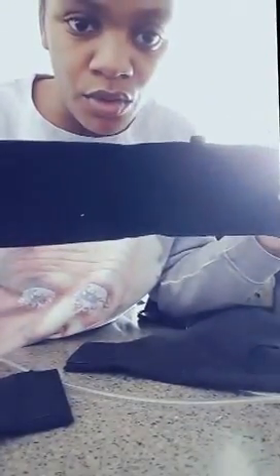So you can get these at Target, Walmart, Amazon, eBay. I think the cheapest one I've seen was $12, and they go up from there. So it's really simple to put on. It's one size fits all with an adjustable back. So this is one side of the bra. This is the other side of the bra. They connect with a Velcro connector. You put it on either side to what best fits you.